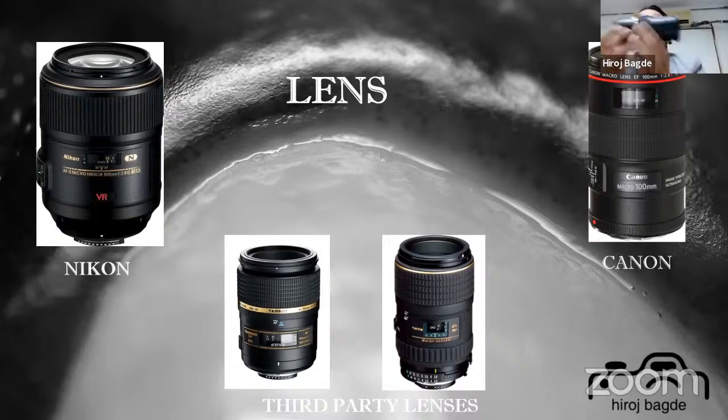When I am talking of 1:1 ratio, it means the image which I am supposed to capture will be the same size on the sensor whenever I am clicking. So if I go towards 1:1, the size of the lens has increased. This is the disadvantage, because I have lost the distance I was supposed to have with 105 mm. So Nikon dedicated lenses are there. These lenses are again macro lenses which will not open and close like this.